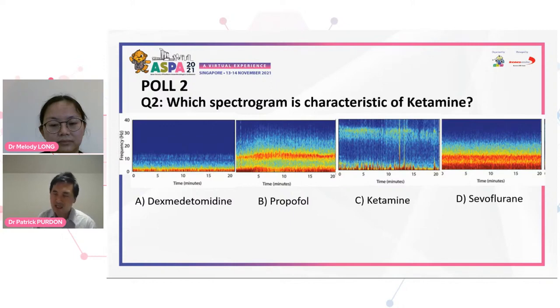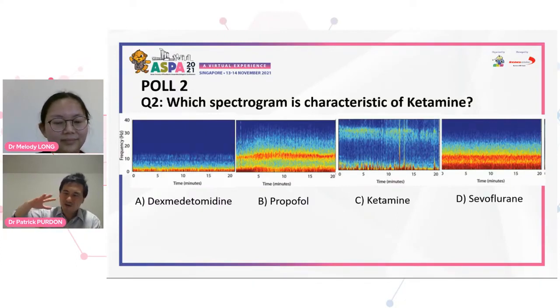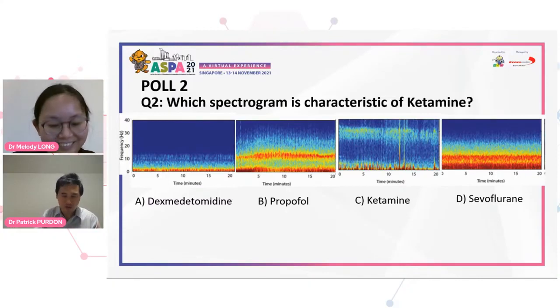So to say that more succinctly, there's plenty of evidence that older patients, say over 60, over 81, have a much higher likelihood of being in burst suppression, even though they're maintained at the correct level of BIS. I haven't looked as closely at, and I'm not sure if it's even available, how the BIS was constructed for children. But I think the converse is true for children. The waves are so much bigger that there has to have been some adjustment to the algorithm to account for that. And until we know what that is or have some more experience with it, it's better to know something about the fundamentals and have that help you interpret the number if that's what you're using.